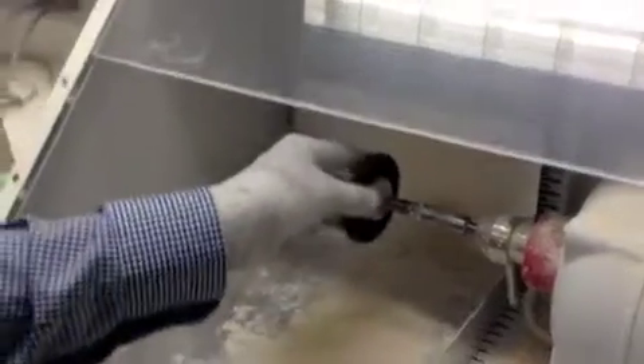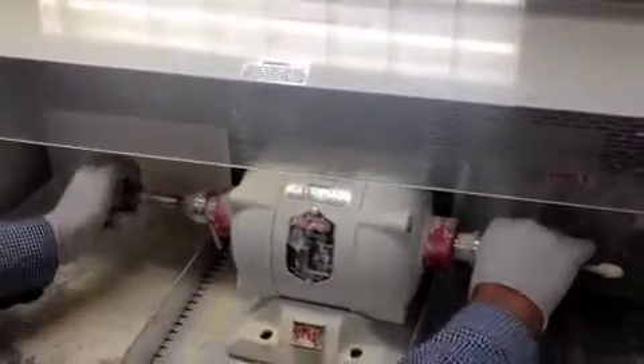Mix your pumice and water to this stage. Then mount the brush by holding the other end and just regularly screw the brush in place.